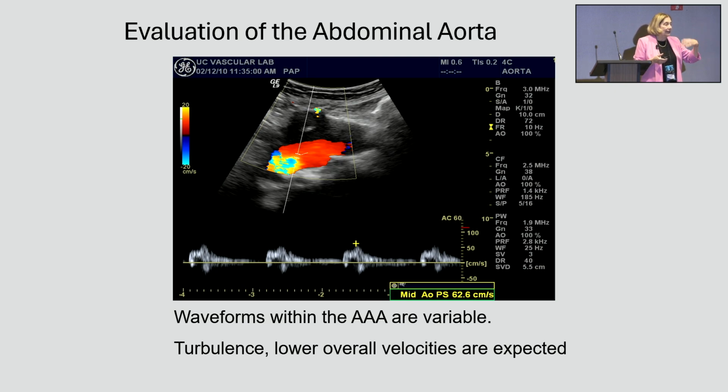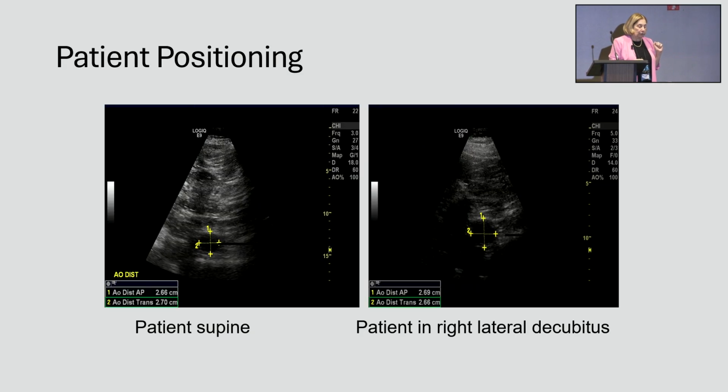There are a lot of different flow directions. Laminar flow goes down a very straight path with minimal branching. How many places in the body do we have that? Not very many, but that's what laminar flow will do. That's not laminar.